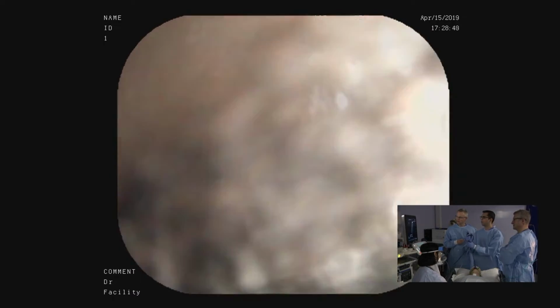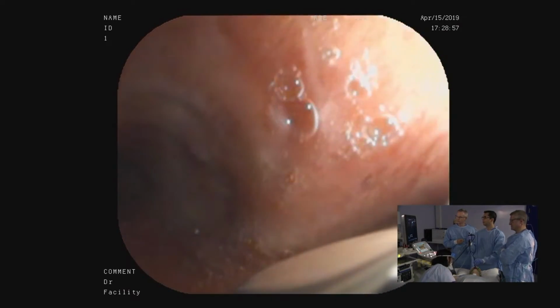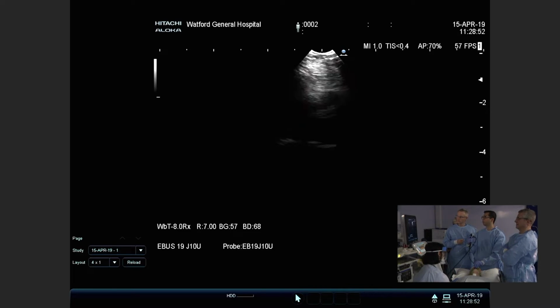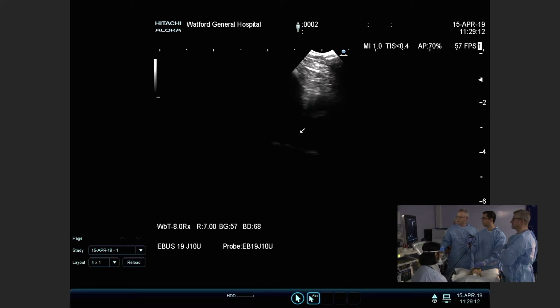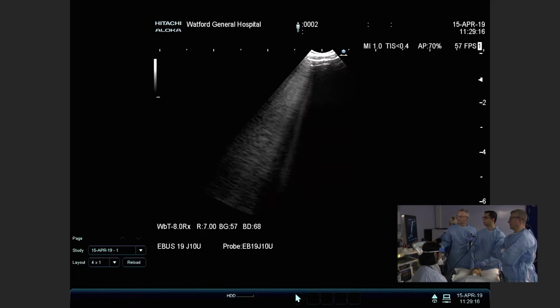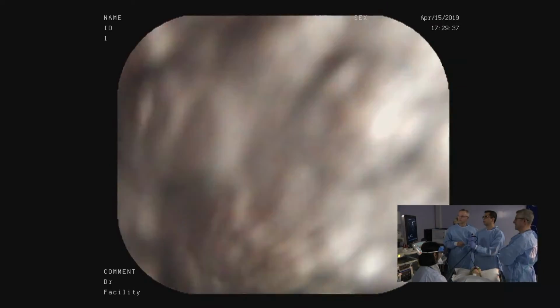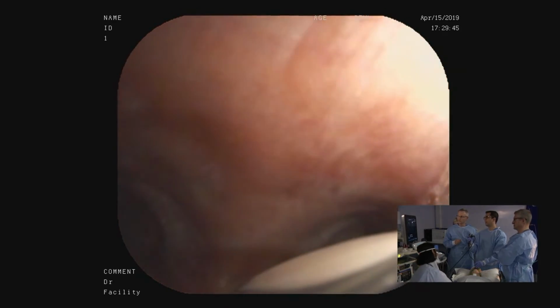And then again, we come back in the left main bronchus. I'm just trying to clear up the view. Okay, this is a better view. So this is the carina, going to the left main bronchus. Now landmark 3, 1 to 2 cartilage interspaces below, and at 12 o'clock, this is where normally you would see 10L, which sits below the left main pulmonary artery. So the one that you're seeing is the left main pulmonary artery? Yes. And just below that there should be 10L, but I can't see it. No nodes there, so that station is clear. On the CT, we definitely saw a small 11L lymph node, but we're not going there yet. So we've done 3 landmarks so far: station 4L, 7 from the left, and 10L, which is left hilar.